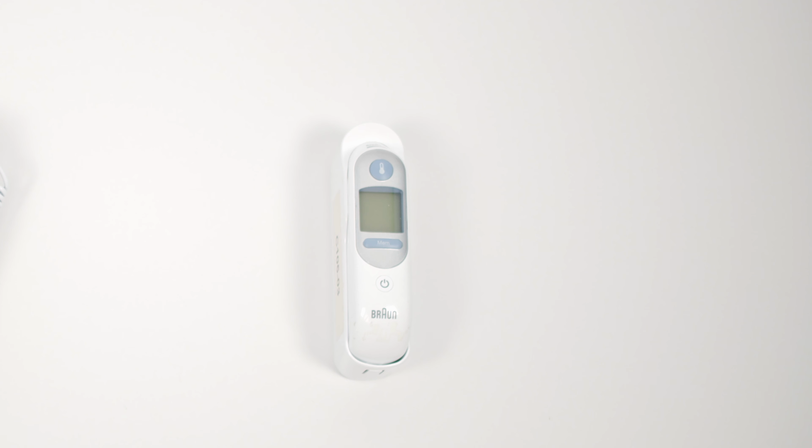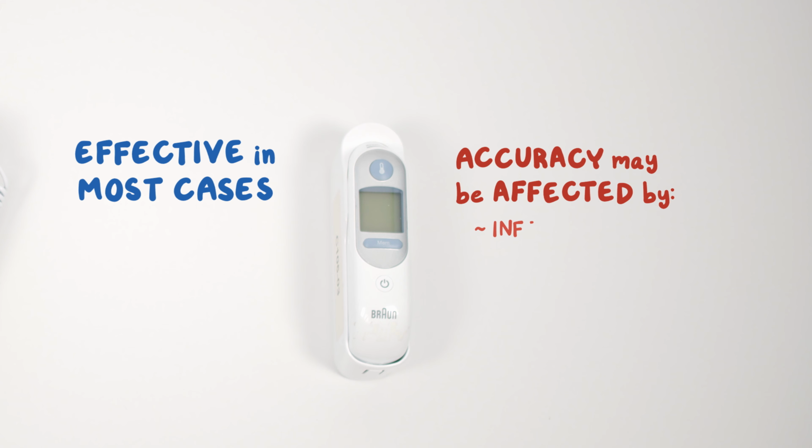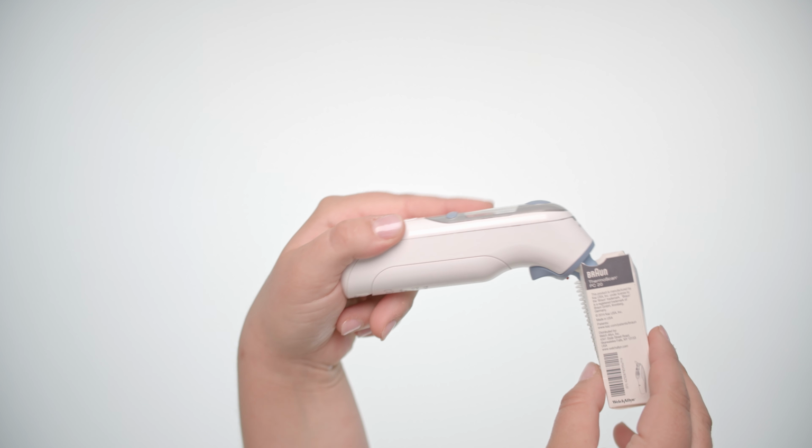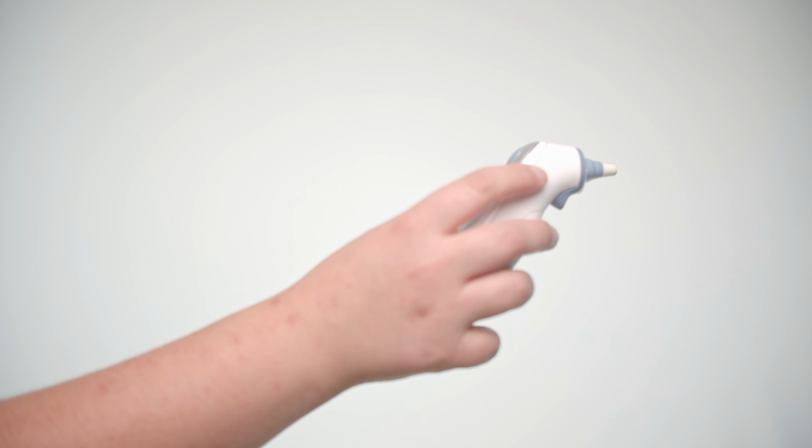The tympanic membrane thermometer, or TMT, measures infrared emissions from Fred's eardrum. It's effective in most cases, but accuracy may be affected by infections like otitis media or just cerumen. Slide a disposable cover over the temperature probe. Now hold the thermometer with your dominant hand. If that's the right hand, place the probe tip in Fred's left ear canal, pulling the pinna back and up.